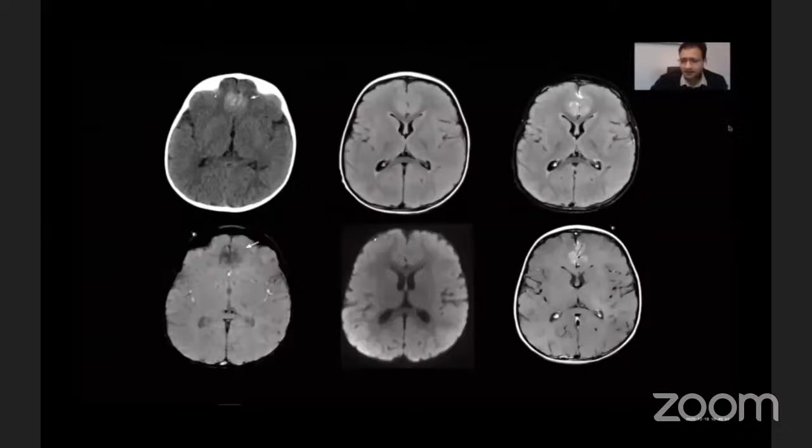And this is post-contrast FLAIR imaging, and you can compare it to the pre-contrast FLAIR imaging. So there is some enhancement of the cortex and bilateral medial frontal lobe, although most strikingly, there is enhancement of the leptomeningeal structures in the involved areas.